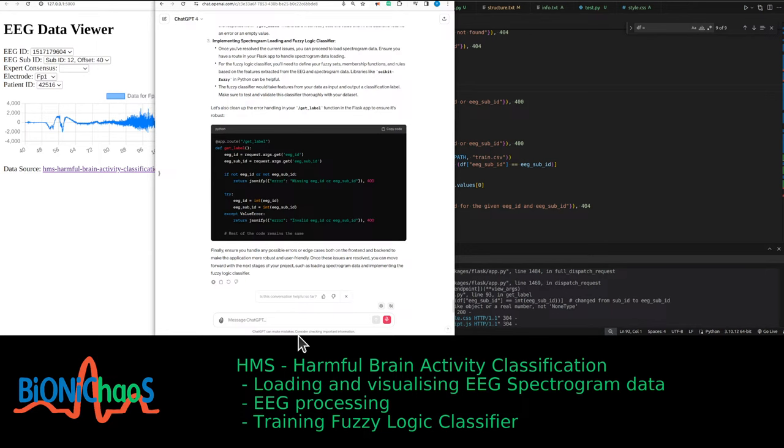1. Verify query parameters in front end. Ensure that when making a request to /get_label, both EEG ID and EEG sub ID are included and valid. Check the JavaScript code where the /get_label request is made. Ensure that the values for EEG ID and EEG sub ID are correctly retrieved and appended to the query string.